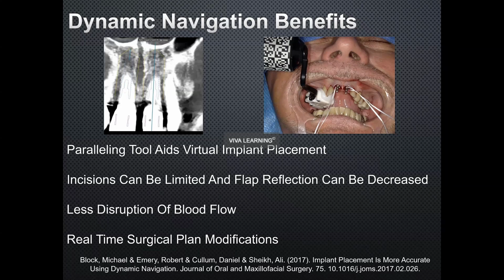So we've got a big area there we want to avoid. You'll learn that we've got markers around these. This is in DTX. You'll see that there's a 1.5 millimeter halo. So that lets you know that we're at least 1.5 millimeters away from the laterals, a good 1.5 millimeters away from the incisive canal. And is there any way that I can parallel these? Because I'd like to place him in a temporary if possible.